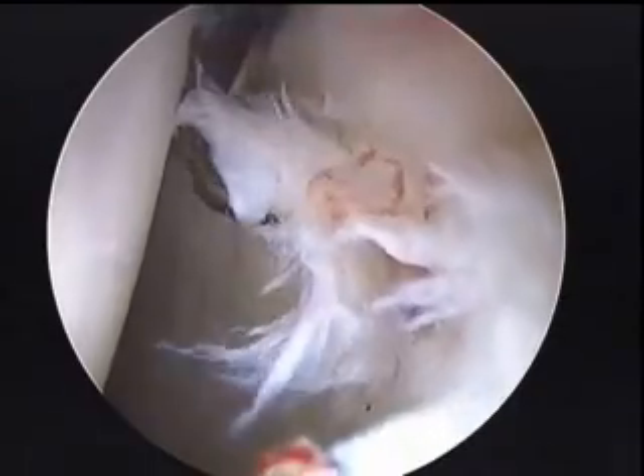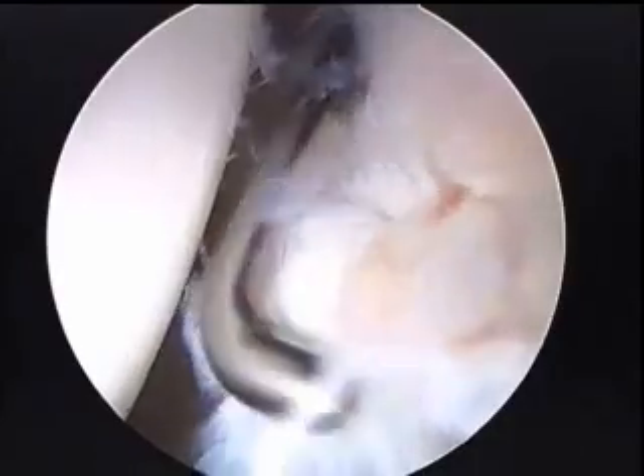This probing shows quite a bit of tearing of the labrum actually coming off the rim of the acetabulum. And this is at the top of it. Now we're looking more posteriorly where the tearing is starting and coming up more into the anterior aspect of the hip.